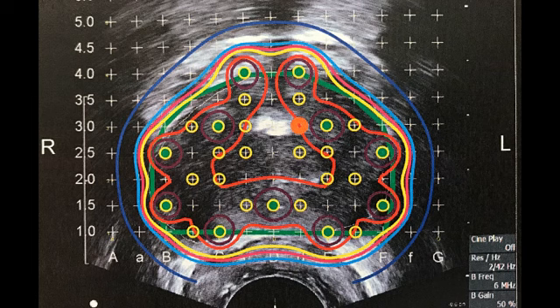So let's talk about how you get there, how ultrasound works. Ultrasound can be described as a pressure wave. So I'm going to try to draw this schematically. What I'm drawing here is pressure. The closer the lines are together, the higher pressure is in this material. This could be air or tissue or water or something. And so it's sort of low pressure, high pressure regions, pressure wave.